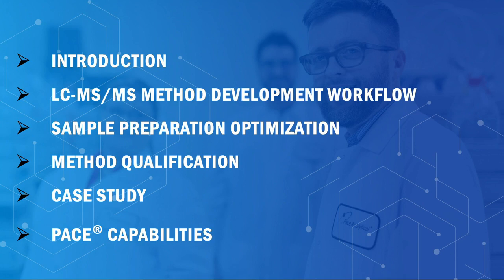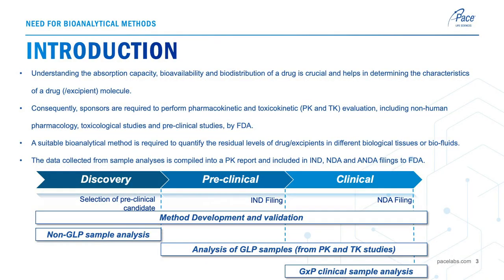I'll then talk about how to make sure that the method is robust prior to non-GLP testing, what we call a method qualification. I'll also present a case study and brief you on the mass spec services that are offered at PACE. So coming to the introduction, why are bioanalytical methods required?